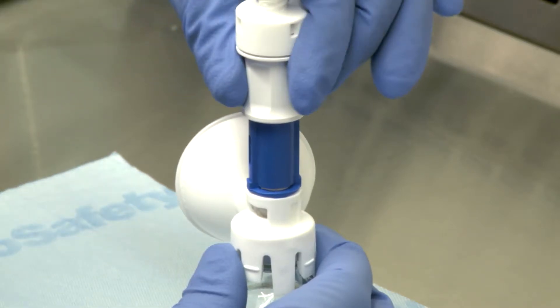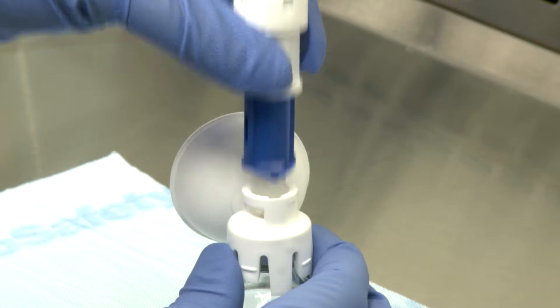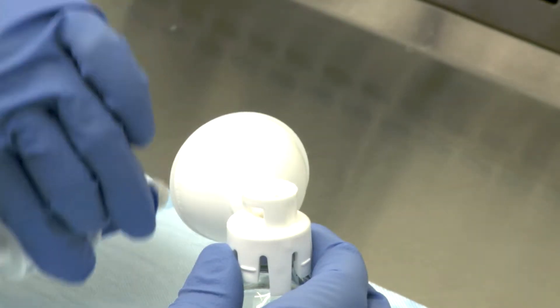Hold the white finger grip and turn left or counterclockwise. Then pull the injector to remove it from the mating component.